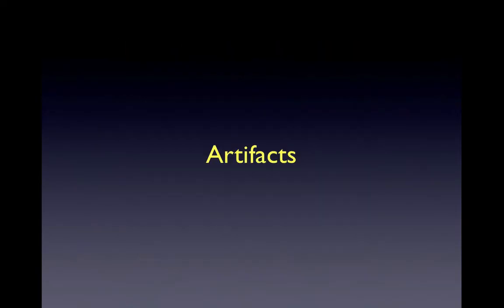Okay, as a final part of this lecture, I'm going to briefly discuss artifacts. What exactly are image artifacts? Well, one definition is that it's any echo information that does not correspond to accurate anatomical information. So in other words, we're performing ultrasound, we're obtaining images on the screen, and we're trying to interpret what we're seeing on the screen. There's accurate interpretation of the images, which requires an understanding of anatomy and anatomic reflections. We expect to see these on the screen. But then there are non-anatomic signals that appear as the result of artifacts.